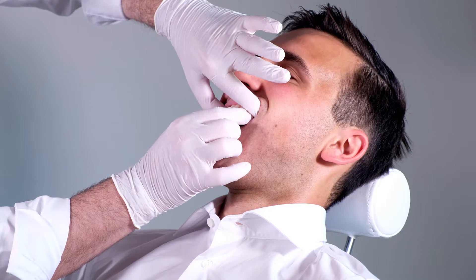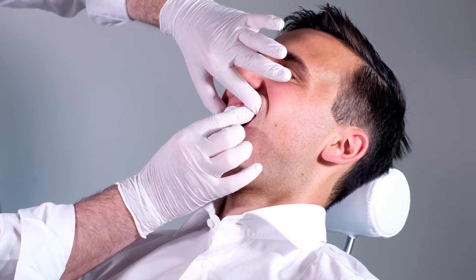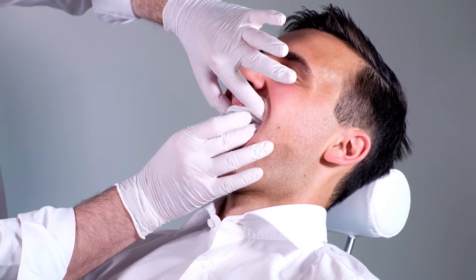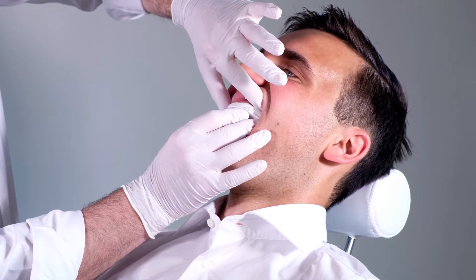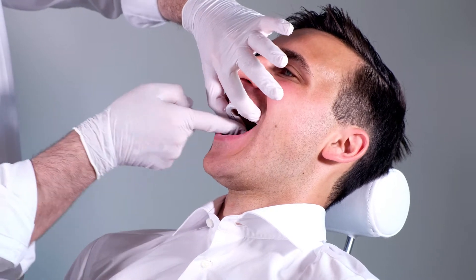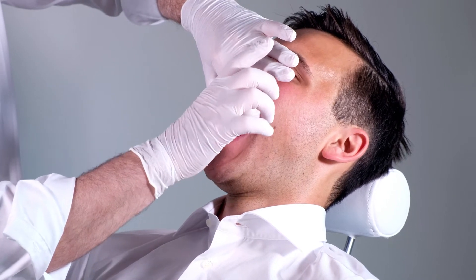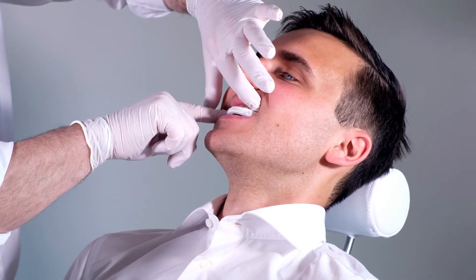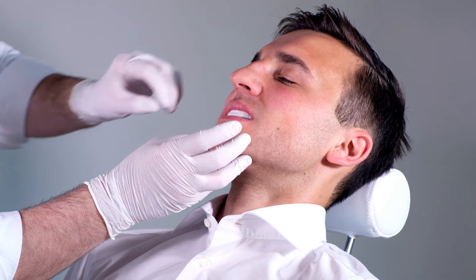Holding the fixation knobs, place the tray centrally under the upper teeth with the line mark on the front edge between the front teeth. If the tray doesn't match the dental arch, the width can be altered by gently pulling the fixation knobs apart or pressing them together. Press the bottom of the tray from the front to the rear against the upper teeth using your thumb and forefingers. Keep the tray in place and gently press the thermoplastic material with your fingers at the outer and inner wall of the tray against the teeth.